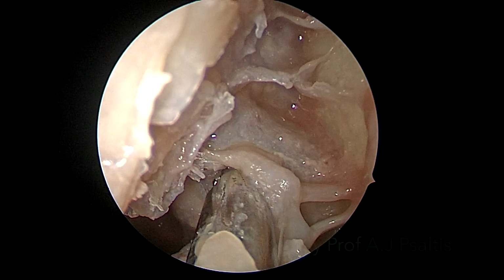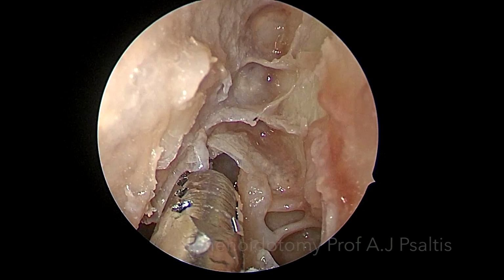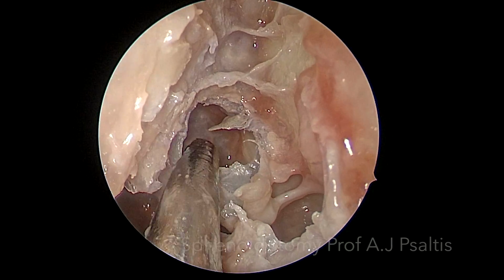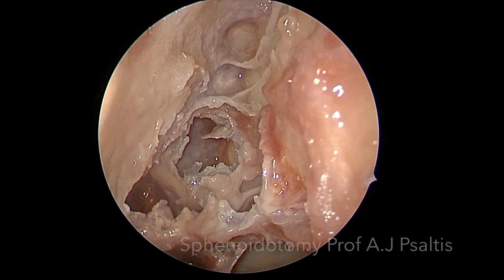I will now demonstrate a sphenoidotomy. The sphenoidotomy can be performed before completing the ethmoidectomy or after completing the posterior ethmoidectomy. Here you can see that we are removing the last partitions of the posterior ethmoid cell, and we can visualize the rostrum of the sphenoid in the distance.